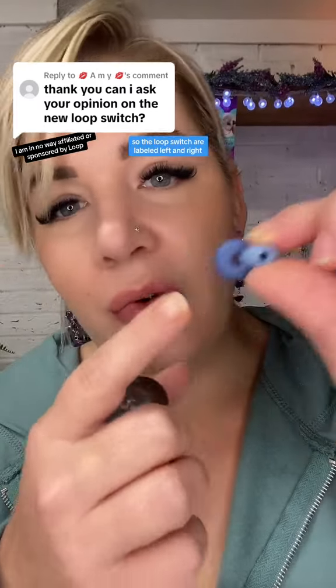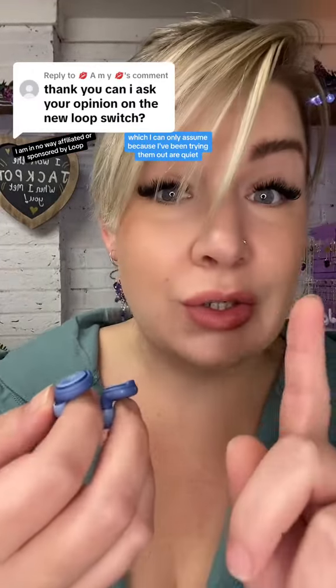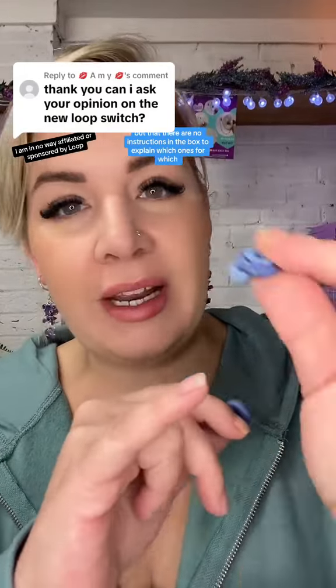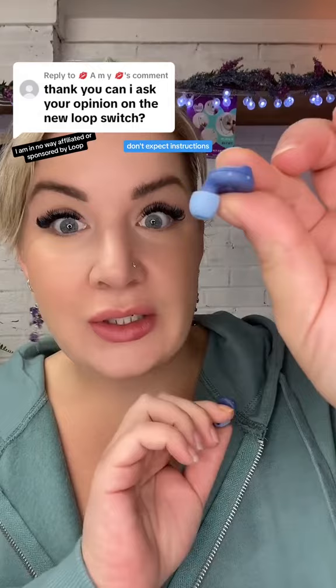The loops are labelled left and right, so you know which ear they're supposed to go in, which is pretty helpful. On the side you have three markers, which I can only assume — because I've been trying them out — are quiet, experienced and engaged, so low to high. But there are no instructions in the box to explain which one's for which, just a QR code. So if you don't like scanning things to find out, don't expect instructions.